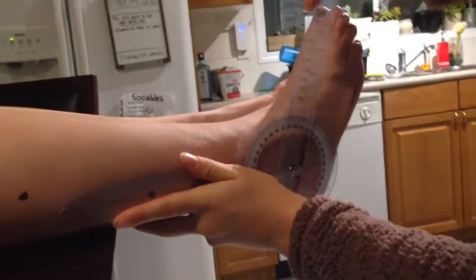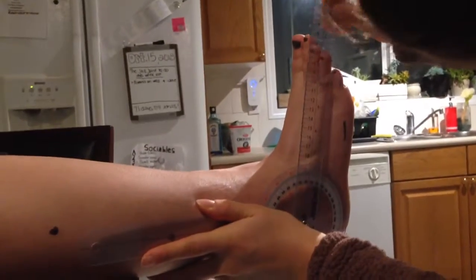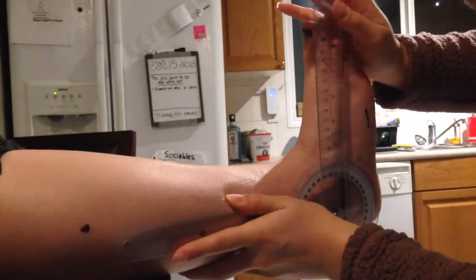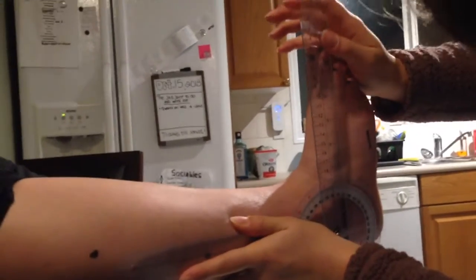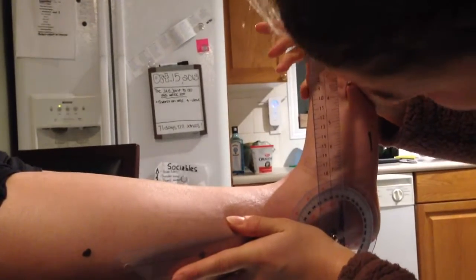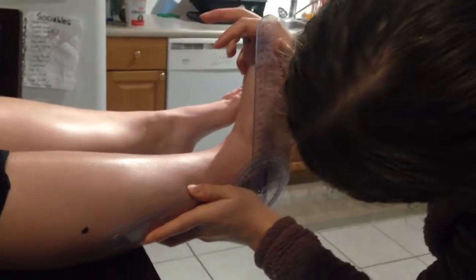Okay, I'm going to go over to the other side, lining up the exact same landmarks as the other foot. I'm gonna get you to start at 90 degrees. Okay, and bring your toes to your nose. Okay, that looks to be about 15 and is 10 degrees. Any pain with this? No. Okay, I'm gonna apply overpressure. That looks to be about 10 degrees and is 15, firm tissue stretch and feel.